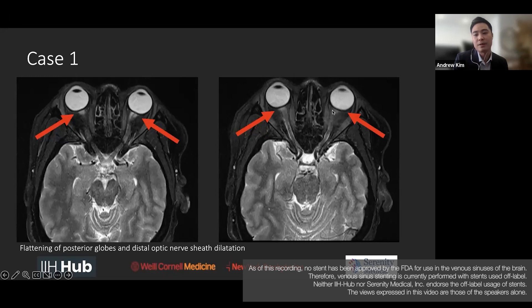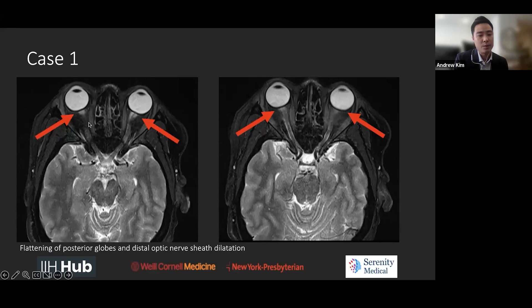You can see that there's some flattening right there, as well as the optic nerve sheaths, which look like they are probably a little dilated distally. You can see the optic nerve, which is a little darker in signal, and there's brighter T2 signal surrounding that optic nerve, representing the CSF.